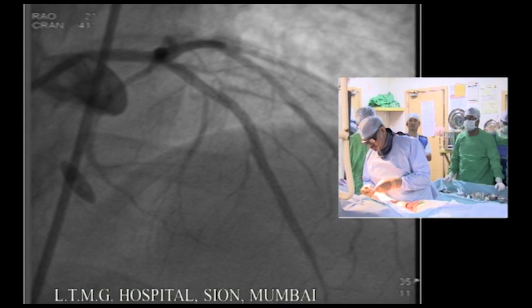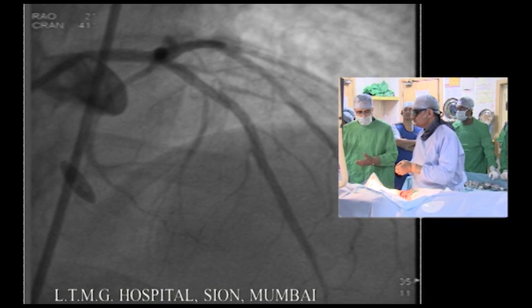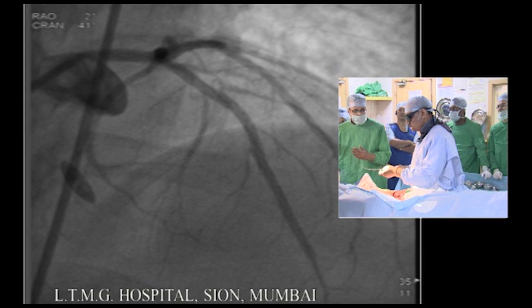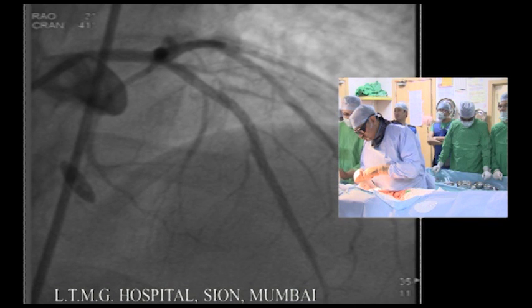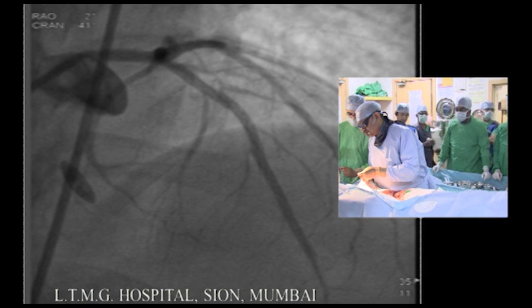That's okay. How many people in the audience would say they would have used what percentage? Less than 20%, more than 20%? How many of you would raise your hand for more than 20% in your labs? Not just yourself, in your cath lab. In your entire cath lab, more than 20%. Only one?